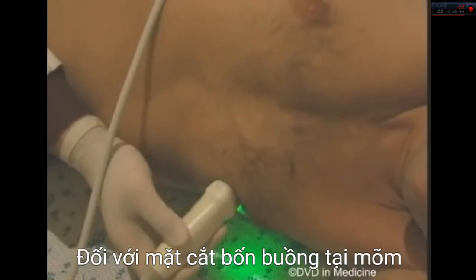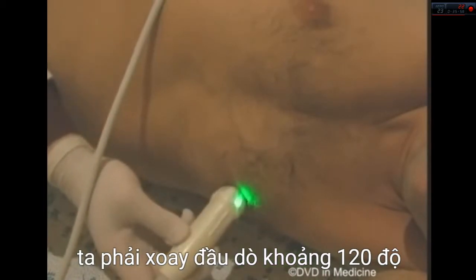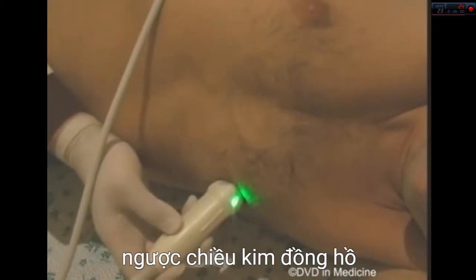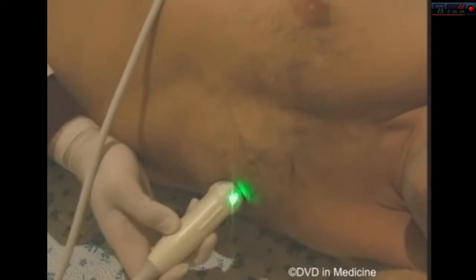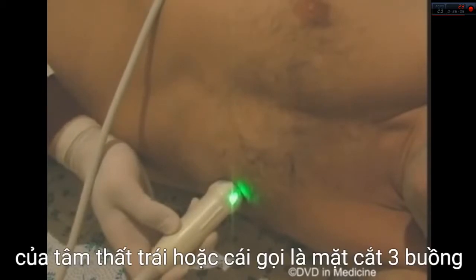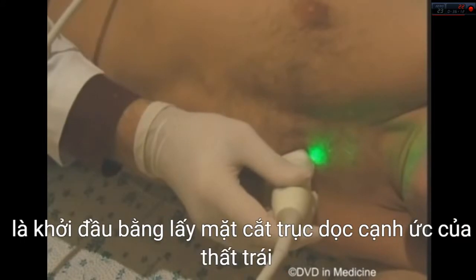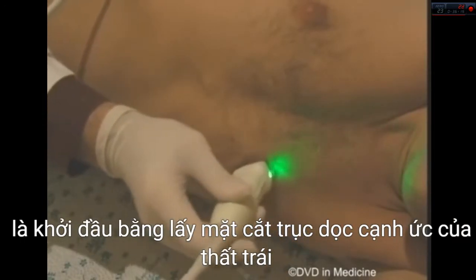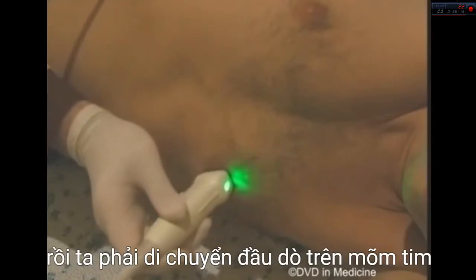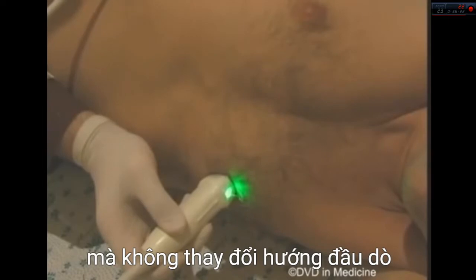From the apical four-chamber view, one should rotate the transducer about 120 degrees counterclockwise in order to obtain an apical long-axis view of the left ventricle, or the so-called three-chamber view. An alternative method of obtaining this image is to initially obtain parasternal long-axis view of the left ventricle. Then one must move the transducer onto the apex of the heart without changing its orientation.